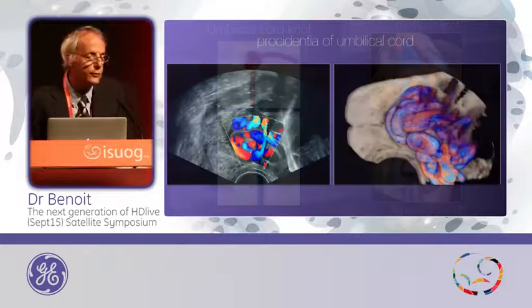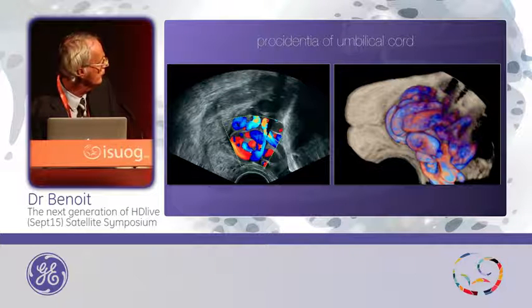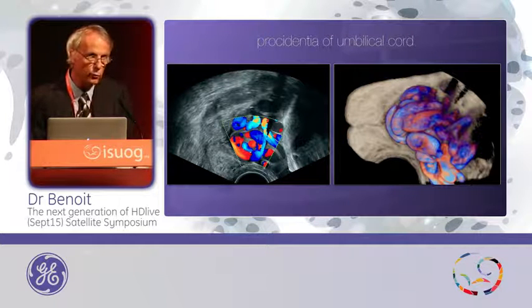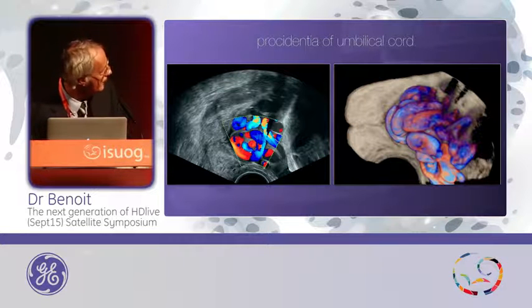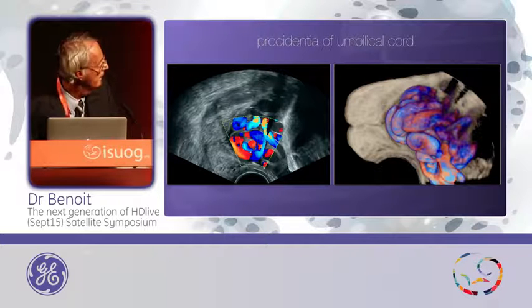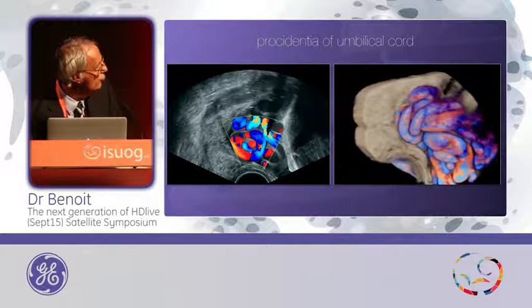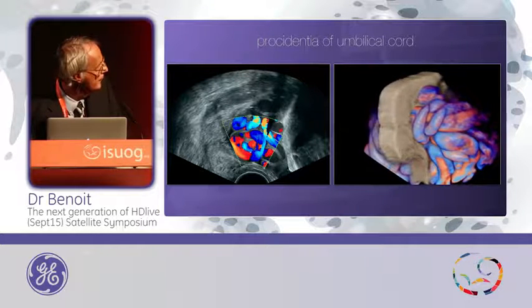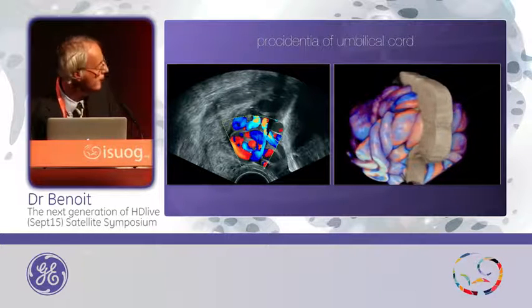This is a cord prolapse. You can see this was obtained with a transvaginal probe — a short cervix with umbilical cord. With a magic cut, I removed only a part of the cervix to obtain only a slice of the cervix, and you will see with this new rendering this cervix and all the loops of the umbilical cord. It's a nice picture, but when I show this kind of picture to obstetricians, they don't like it.